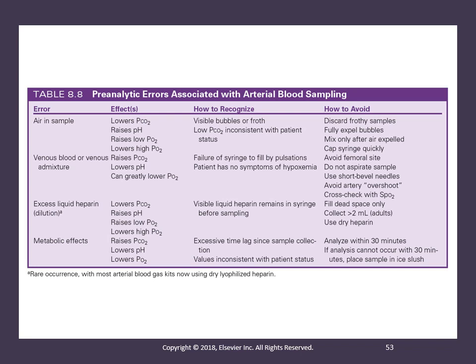For example, the calibrating media for a standard blood gas analyzer includes precision mixtures of oxygen and carbon dioxide gas and buffer solutions with known pH values. During this automated or semi-automated process, the analyzer adjusts its output to correspond exactly to the calibration media's known values.